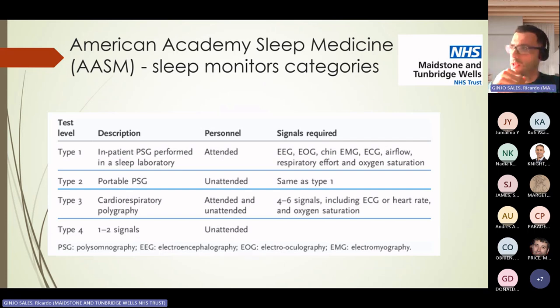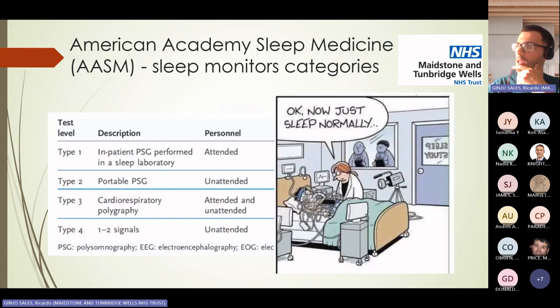with a number of electrodes on the head, chest, legs. Usually if the patient is staying overnight, it takes 1 hour to set up everything. After the setup, we ask the patient to just sleep normally, which is really difficult with all the wires and hospital environment with staff around, being recorded on video, staff in and out, just fixing some electrodes. Yeah, it's really difficult, but in the end we just ask the patient to sleep normally.